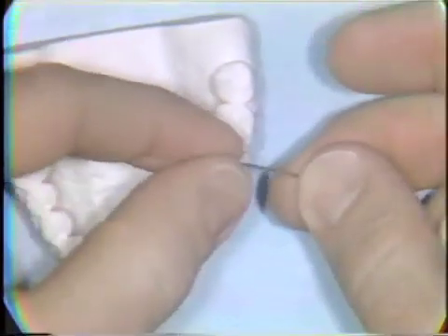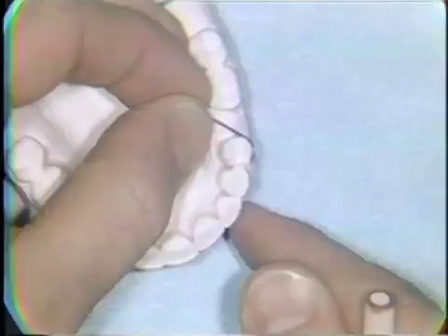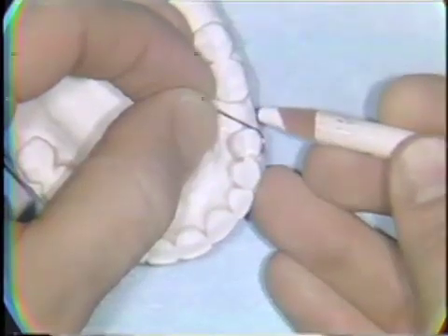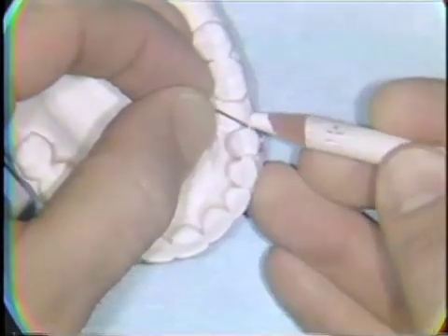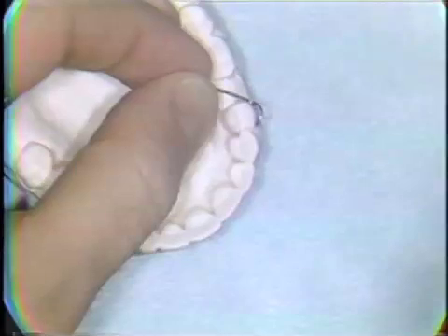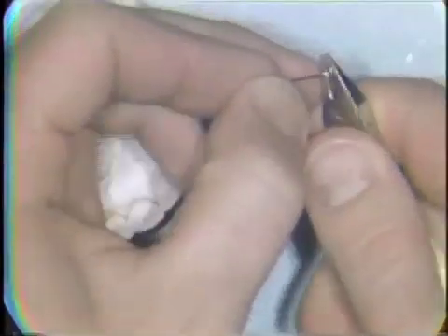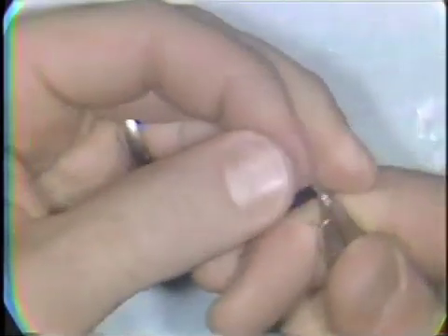You try the wire back on the model. The wire should adapt just above the free gingival margin. A mark is made at the point where the wire should extend into the palatal area. A series of small bends is made to sweep the wire into the palatal extension.